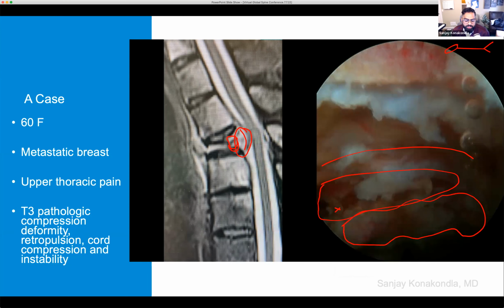Sometimes with folks with poor bony quality, putting in the instrumentation can wash out some of our bony identifiers. So I'll drop in K-wires to have those static placement markers for our levels. Then you don't have to think about if you're at the right level. Obviously, with a compression fracture, you're seeing it throughout the case. From a workflow perspective, I'm dropping in wires, and then I'll go with the transforaminal approach here. And then I'll do most, if not as much, of the ventral component as I can.